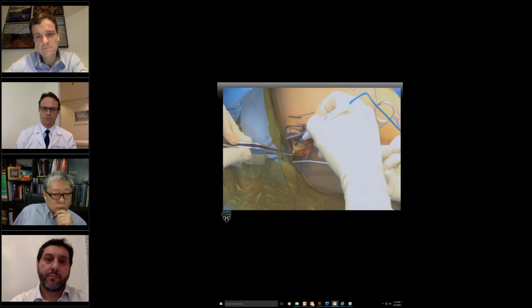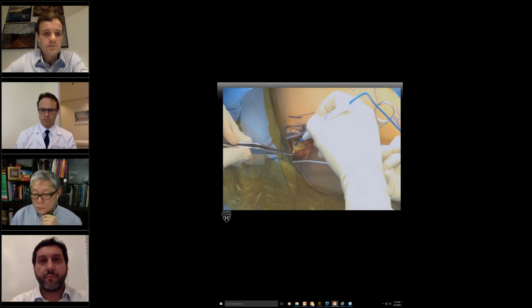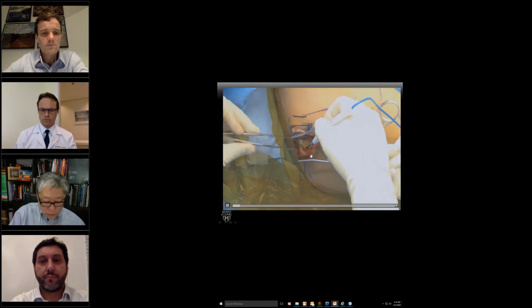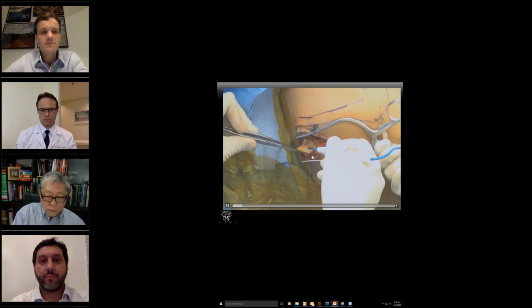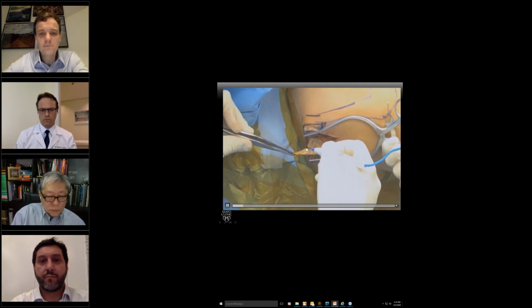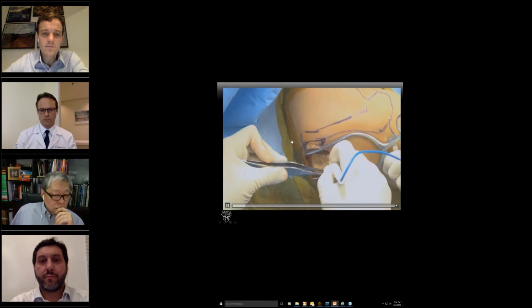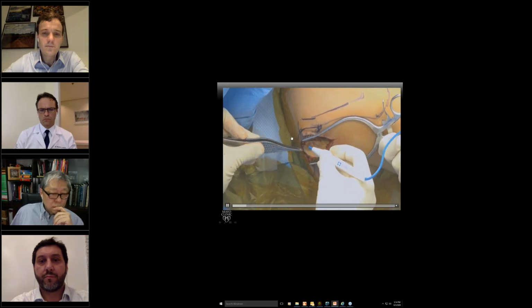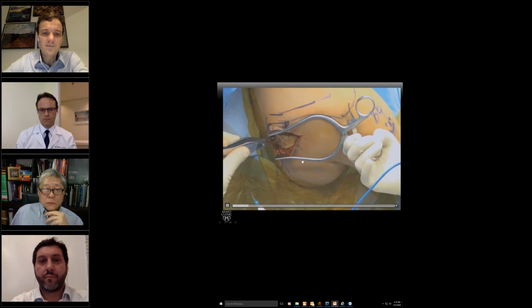But once you open the skin and retract it, there is always a layer of fat. You pull on it, you don't go straight vertical on this fat, you go parallel. As you're pulling with the cautery, it almost peels the fat off your tendon. And you do it until you see a tendon. You don't convince yourself that you're seeing it. The tendon, remember, is going to be down this angle here. Now you take some of this fat and take a look. Can I see it? No. So you keep on taking until you start to see structure that looks like muscle or tendon.